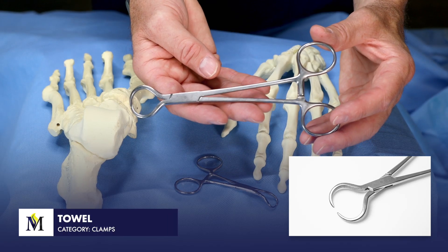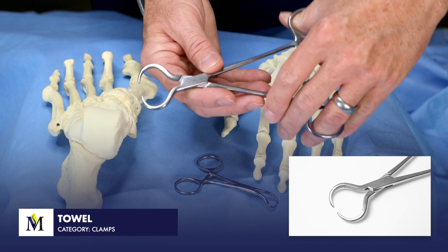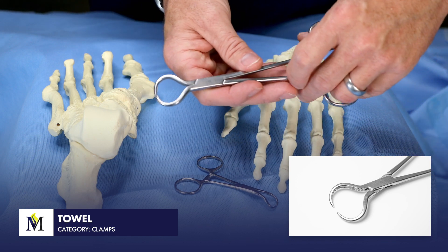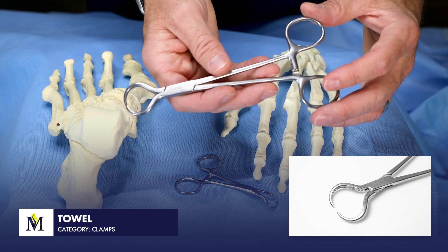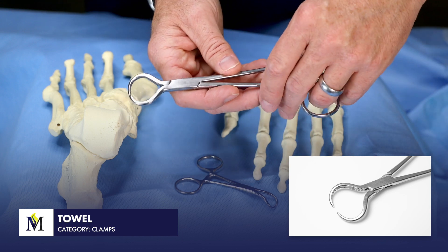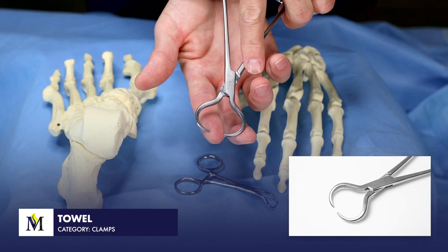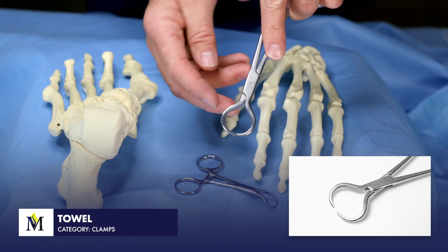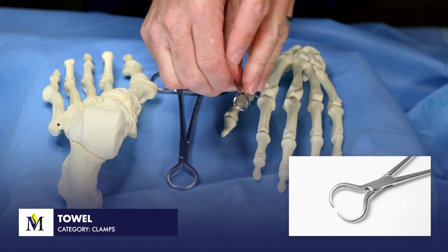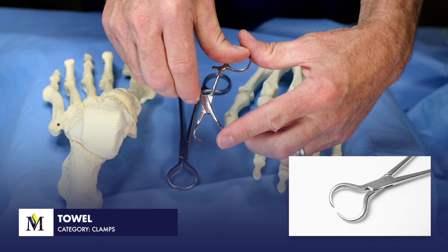These are towel clamps. Just as the name implies, they are used to clamp towels or drapes along the table. The operating room table will have various towels and drapes that need to be secured. This is a large towel clamp with very aggressive, sharp tips, versus a small towel clamp with a much shorter working mechanism.